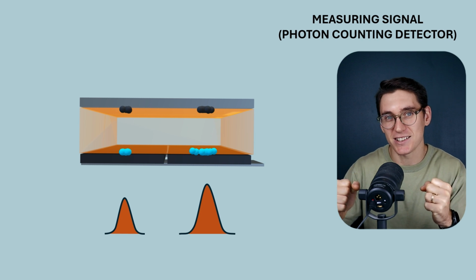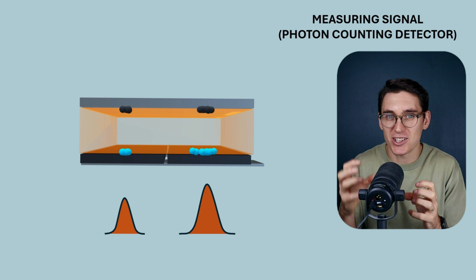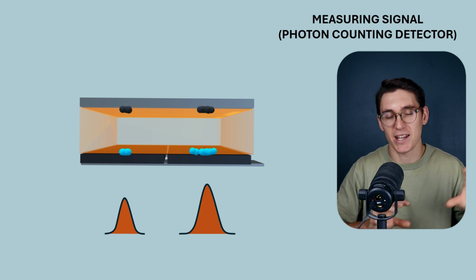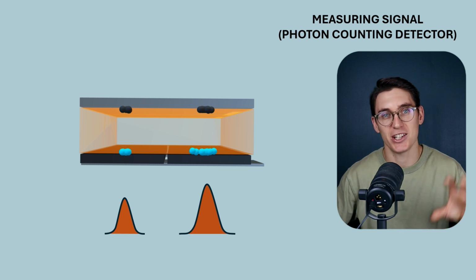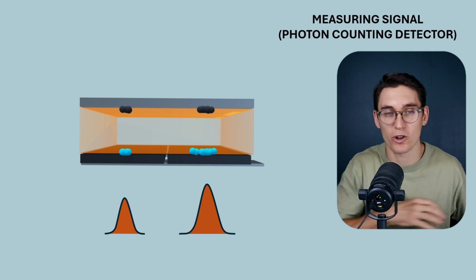Photon counting detectors not only count X-rays, but they bin the X-rays based on the degree of energy that they have. We can separate the X-rays into multiple different energy bins. High energy, medium energy, low energy bins, and actually X-rays maybe that are so low energy that we want to remove from our sample.